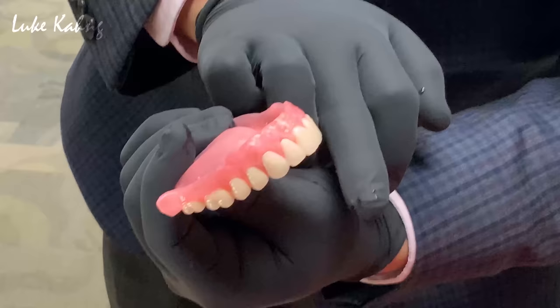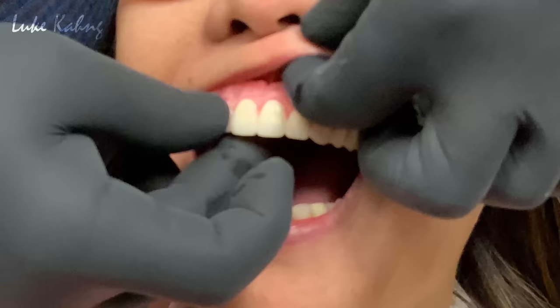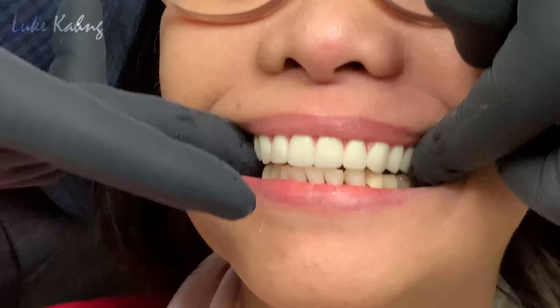Yes. So we have limited room. So I cannot bring more. Otherwise the denture pops out. Okay, right down. I don't want that. Take a look with the mirror and you're going to see it's less bulky. It's less. See? It's inside. Just a little bit right there, right?